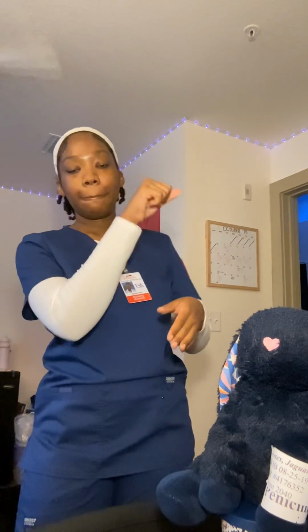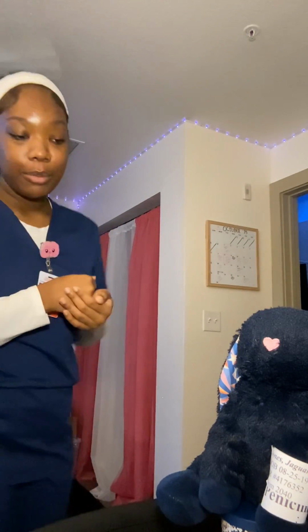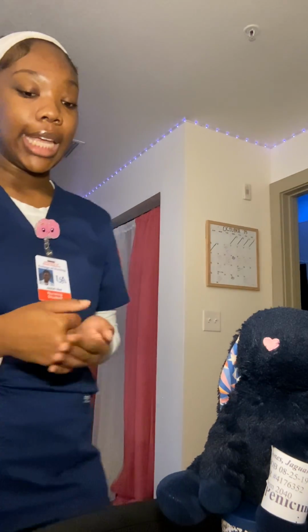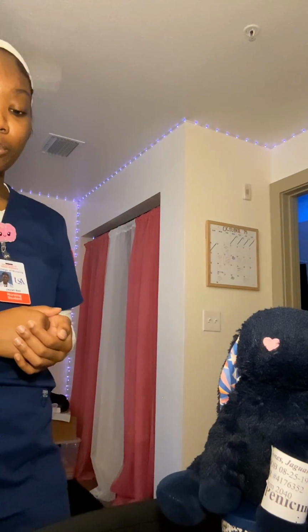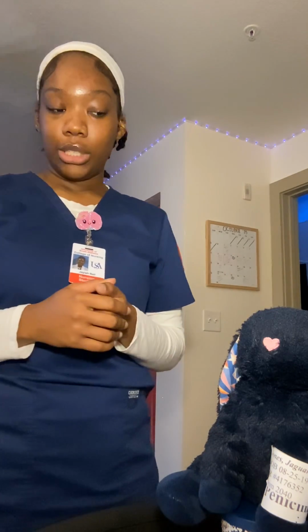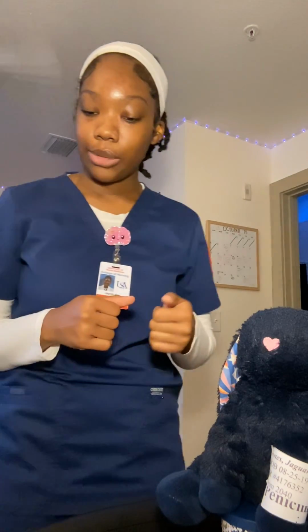Alright, so now I'm in my patient's room for one knock. And I will enter, do hand hygiene, introduce myself. Hey, Mr. Jones, my name is Jayla Bell. I'm a student nurse at the University of South Alabama, and today I will be giving you your insulin. But before we do that, I just want to go ahead and start my third check of 7 rights. Make sure I identify you correctly and make sure everything is still correct, all right?